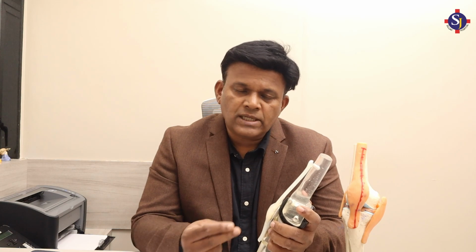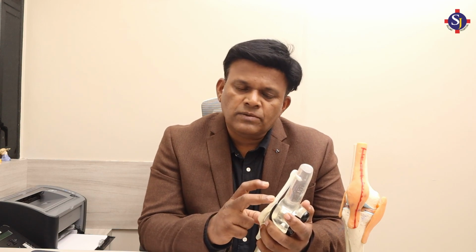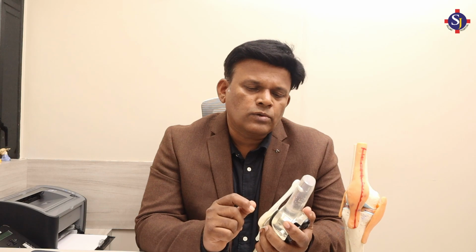One is a good implant, which is a high flex implant. Use only imported, high flex implants, and proper cuts and meticulous closure with a small incision, minimally invasive surgery, that is MIS. So these 3 are the pillars of knee replacement surgery to get an optimum outcome.